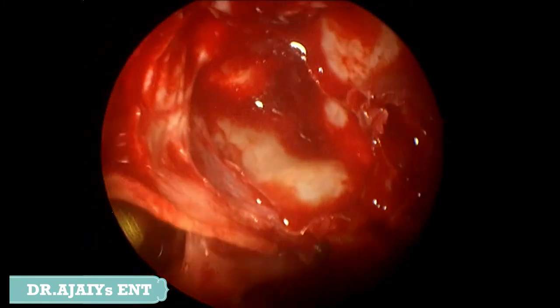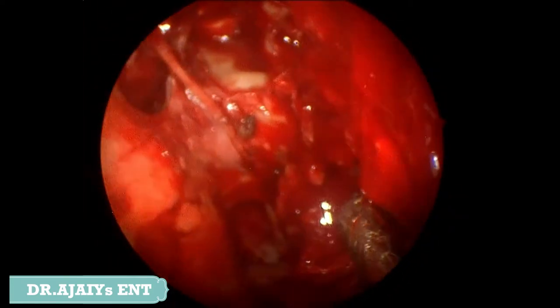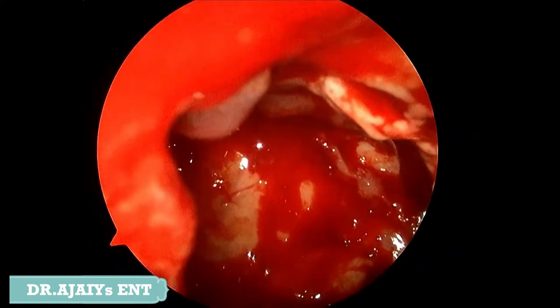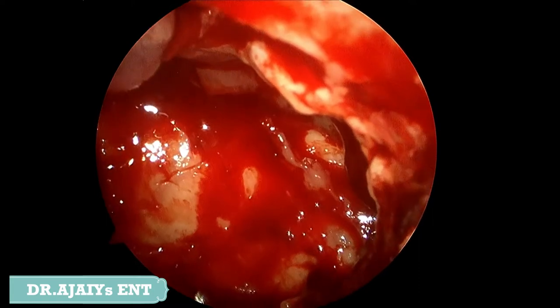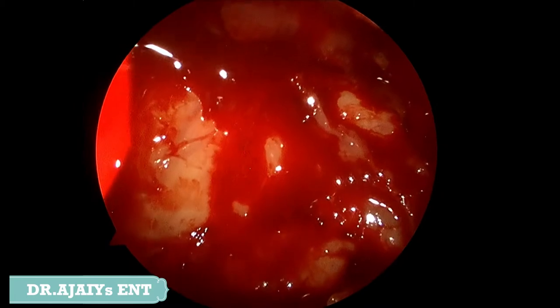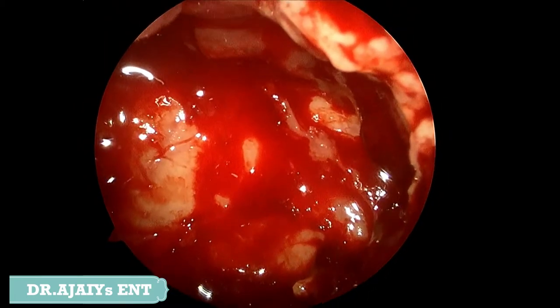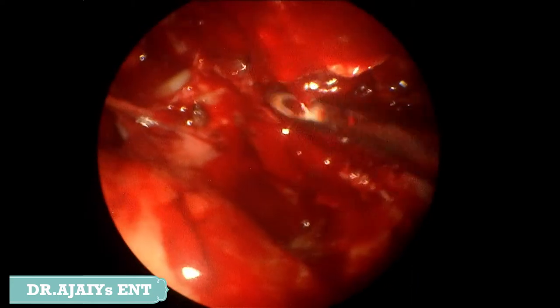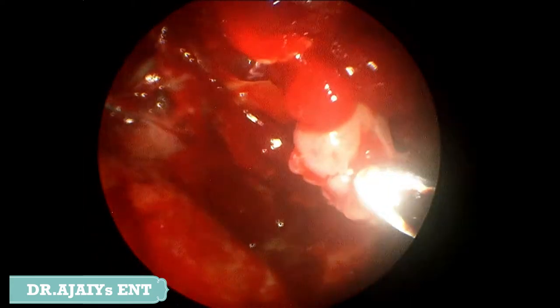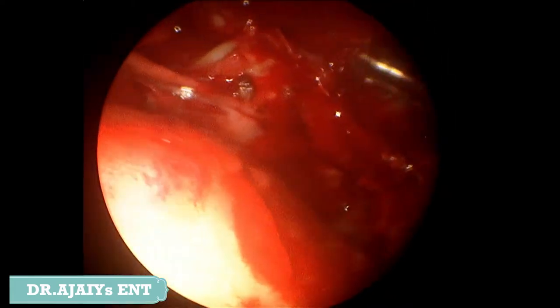This is the final picture of our ethmoid. We did the sphenoid also. We could see the lamina papyracea on the side, which was normal. Until this point we used a 0-degree endoscope. Switching to a 70-degree endoscope to see up to the floor, to our surprise we could see additional contents along the floor and roof of the maxilla — that is, along the floor of the orbit — and we began removing the necrotic contents from the floor of the orbit.